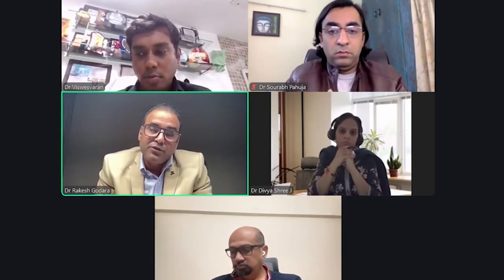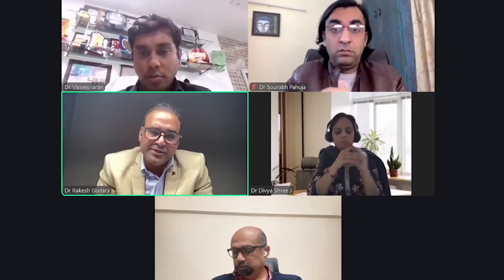And also we are ready for the post procedure, like if I need to manage the patient in the ICU, or I need to extubate immediately on the table, and all these things. So these are the things that can very well be managed in this way.